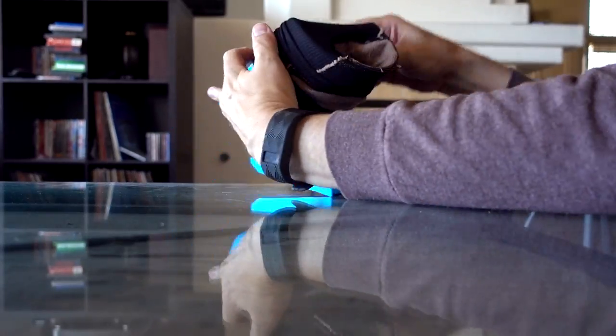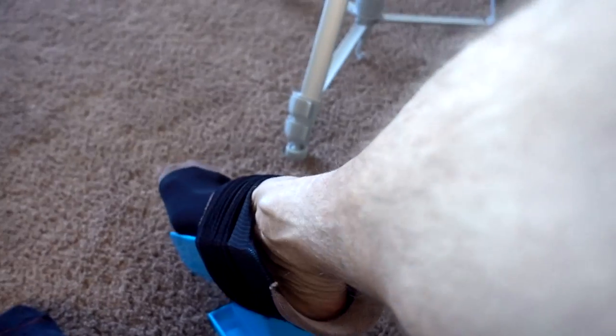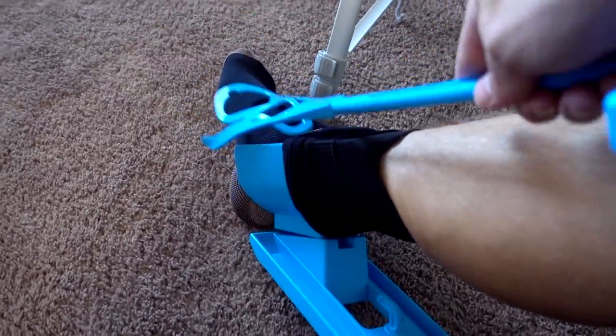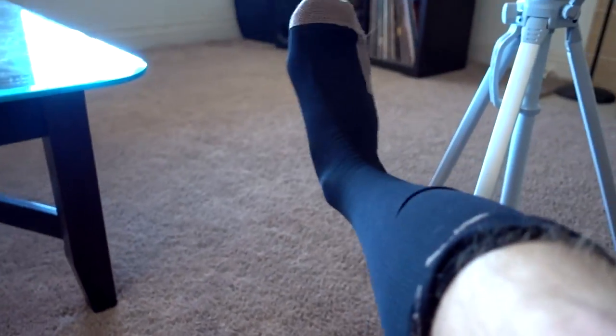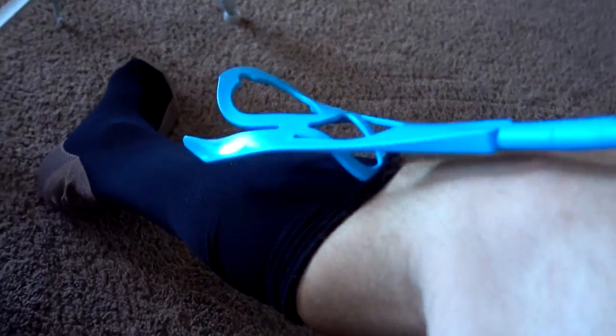I think I actually got the toe up here. Compression socks, take two — I think I got it. Now it's stuck here, but I guess that's what the handle is for. I actually did it — not completely straight, not perfect, but I did it. There were instances when I had longer socks where my toe didn't get to the very end, so I had to put them on a second time. One occasion, the device actually fell apart.